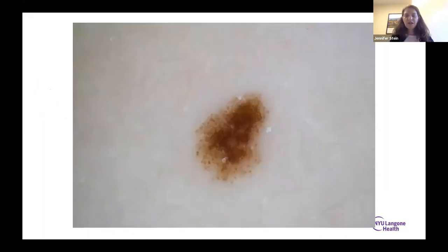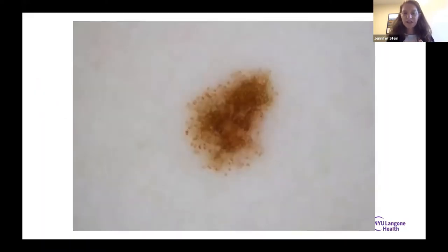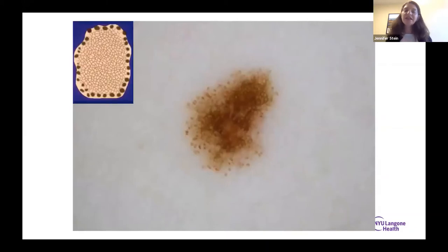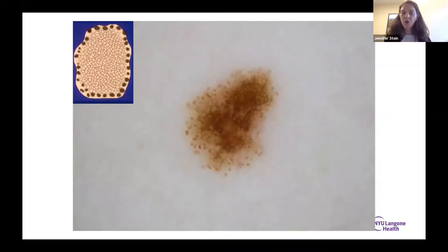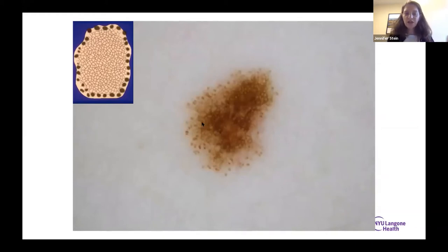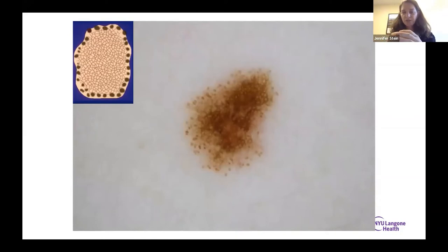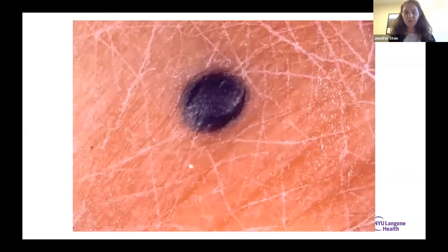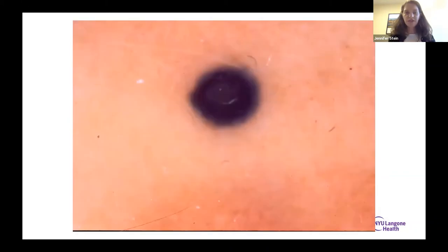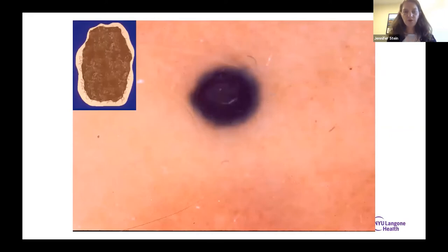This pattern — network in the center and globules around the edge — tells us this is a growing mole. Growing moles are not necessarily bad; new moles have to start somewhere. On the back of a 16-year-old girl, no big deal. You can impress patients by saying, 'I bet this is a new mole,' and explaining it to them. Expect it to just grow nice, slow, and steady in all directions. This dark blue one is just a blue nevus — blue nevi are homogenous blue. No problem.